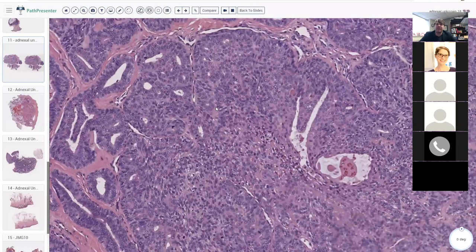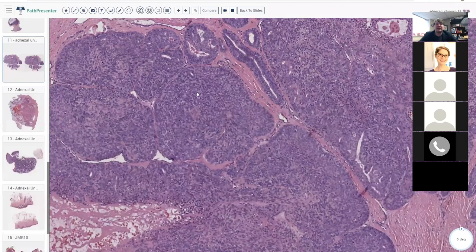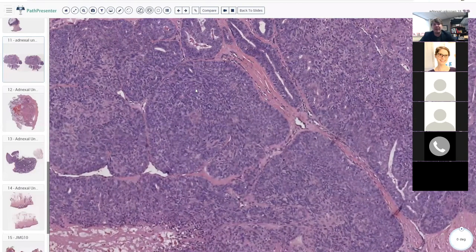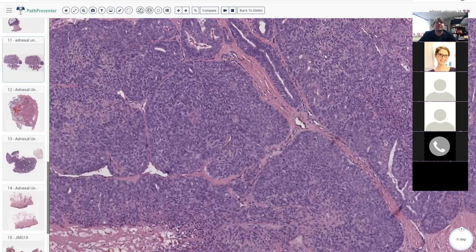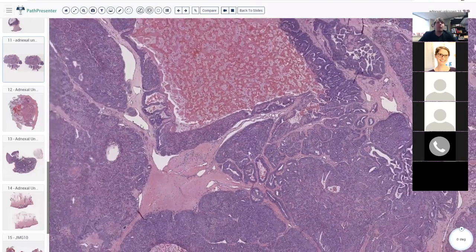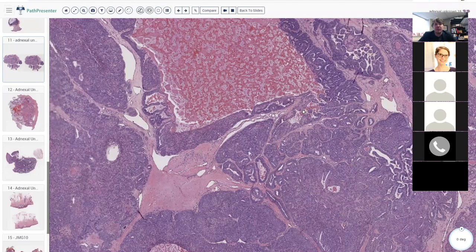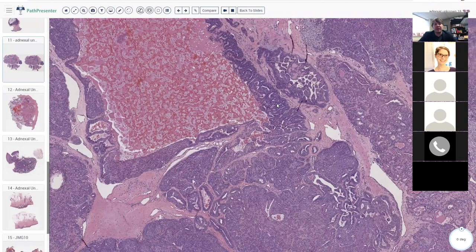One thing I find pretty helpful is this sheet-like growth with little tubules — it's a look this tumor has that you don't see as often in hidradenomas. Sometimes it almost gives a biphasic appearance that reminds me of synovial sarcoma, with oval cells in a streamy uniform pattern and little tubular gland-like spaces, similar to biphasic synovial sarcoma. Really important entity to know: they don't have to have atypia or many mitoses to be malignant. If I see cysts and papillae on the hands or feet, I'm almost always going to call it digital papillary adenocarcinoma.